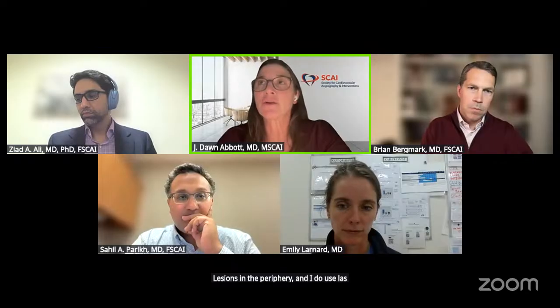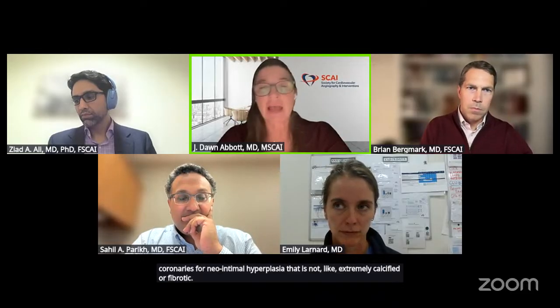Dawn, do you have any thoughts or feelings about it? No, I know with the peripheral space, like Excite ISR, we used to laser DCB a lot of lesions in the periphery. And I do use laser a considerable amount in the coronaries for neointimal hyperplasia that is not extremely calcified or fibrotic, just to not have that tissue there when you're putting a second layer.